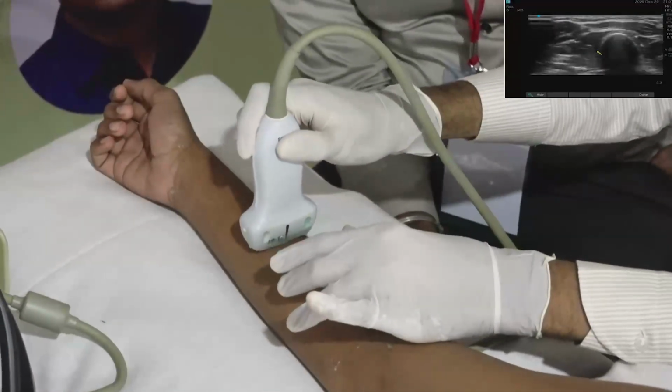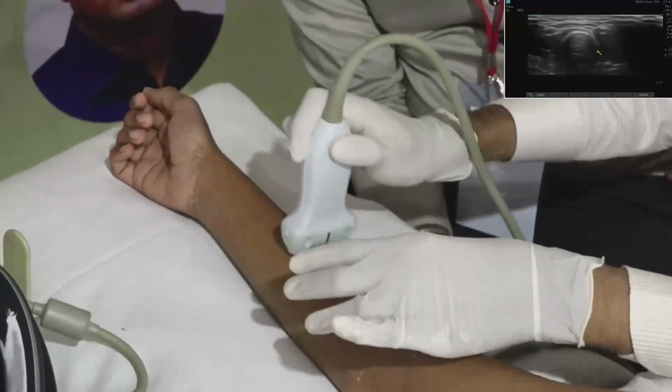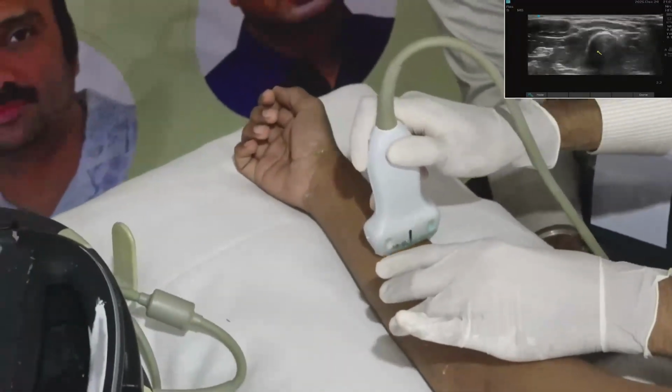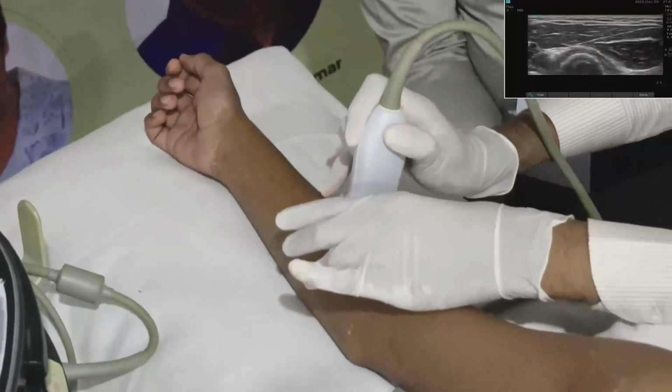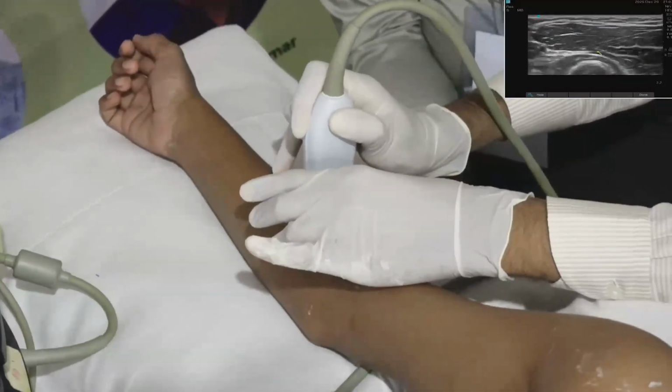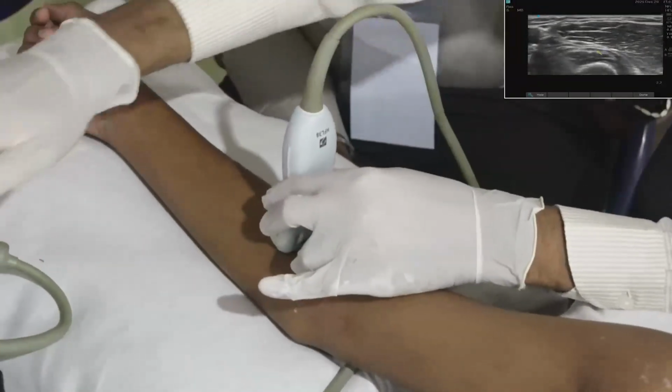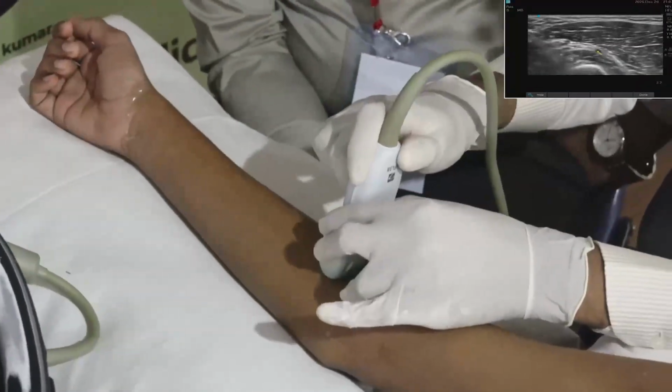So this is radial artery. The muscle component which we are seeing bigger is brachioradialis. The hypoechoic component we are seeing is radial nerve.